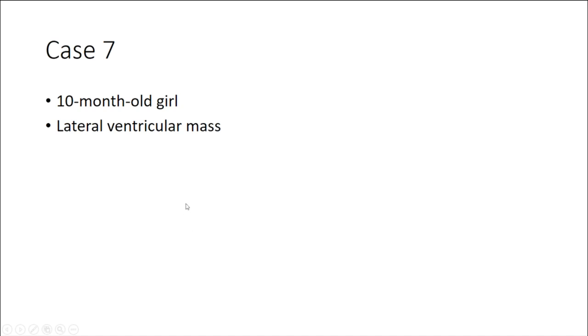Okay, case number 7, another young patient, 10-month-old girl with a lateral ventricular mass.